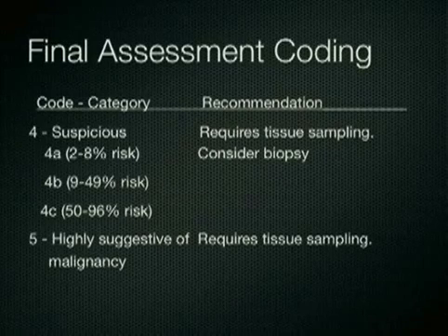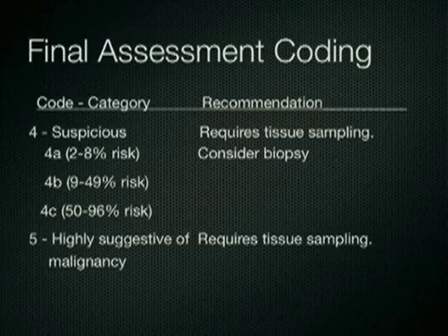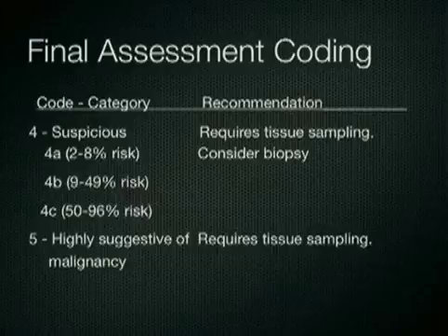In summary, the BI-RADS ultrasound lexicon has become an important adjunct to the BI-RADS lexicon for mammography in the evaluation of patients with breast lesions and in the increasing use of ultrasound to complement mammography in this evaluation.